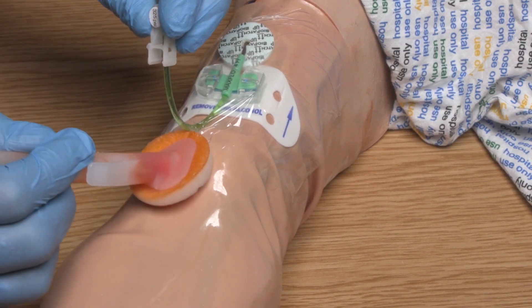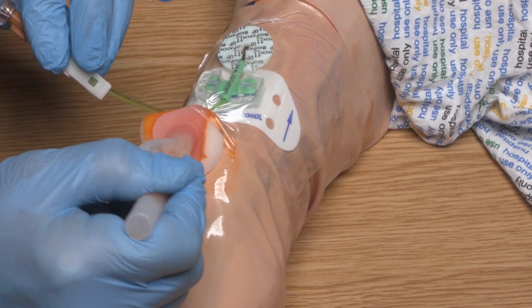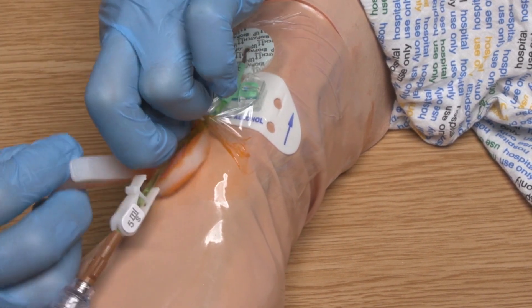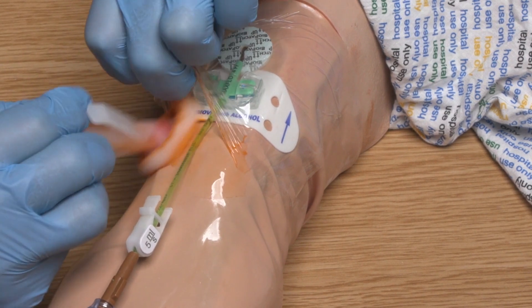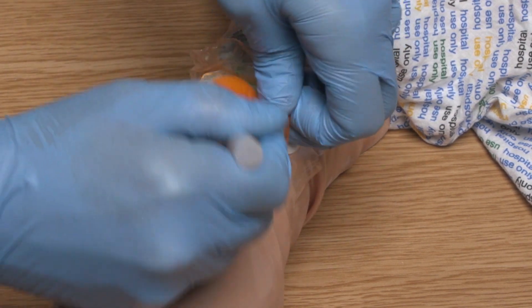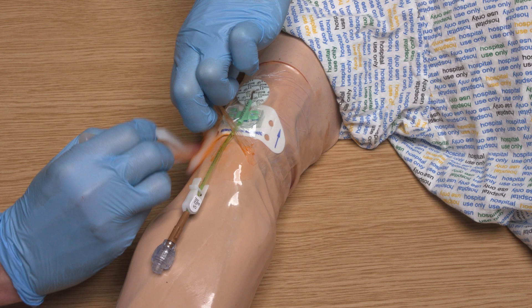I am now going to begin removing the PICC dressing. You can see that I am using the wand to gently remove the transparent dressing by lifting a corner of it and then working the wand underneath it. Continue to do this while removing the semi-permeable transparent dressing. If the chlorhexidine gluconate impregnated dressing has been applied correctly then this should lift away easily with the transparent dressing. When removing the dressing it is important to start at the bottom and remove it gently by stretching it and drawing it away from the skin in an upwards motion, to minimise the risk of the catheter migrating or becoming dislodged.